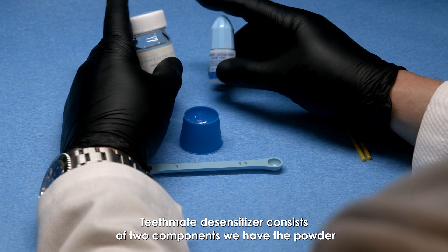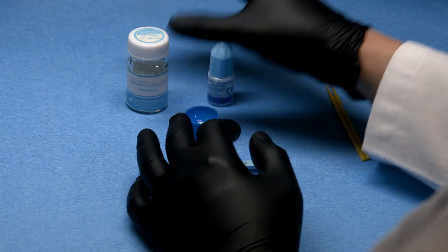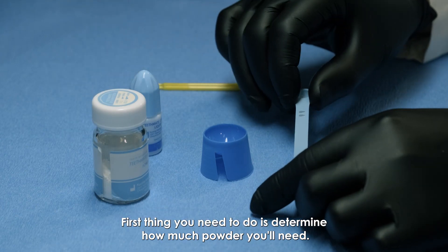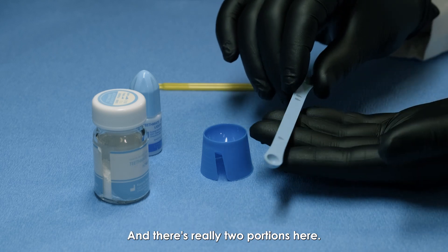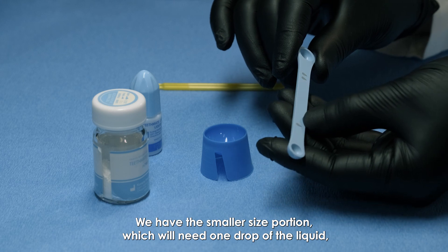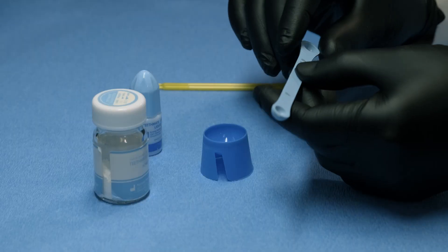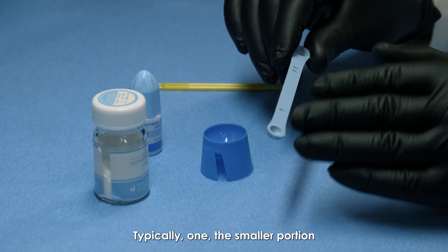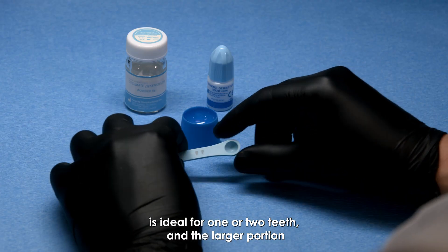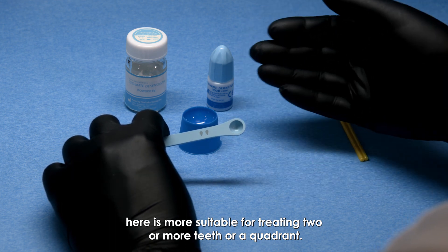Teethmate Desensitizer consists of two components: the powder and the liquid. First, determine how much powder you'll need — there are two portions. The smaller size portion needs one drop of liquid and is ideal for one or two teeth, while the larger size portion needs two drops and is more suitable for treating two or more teeth or a quadrant.